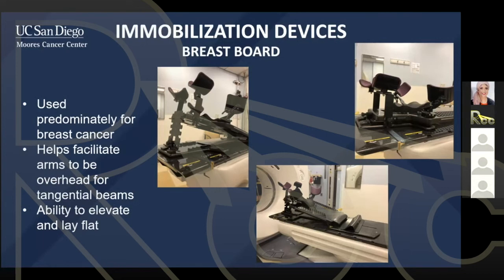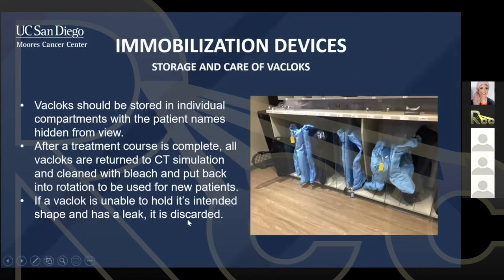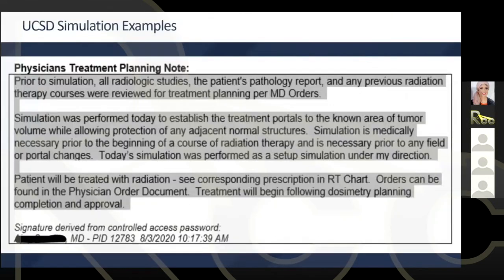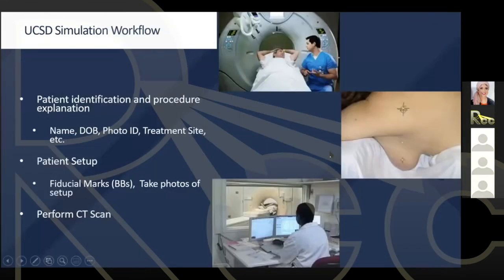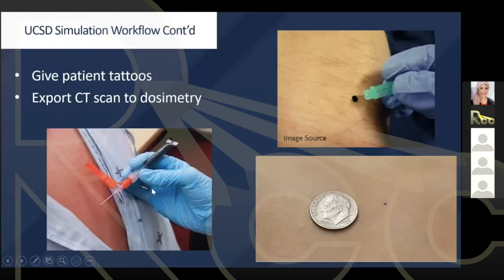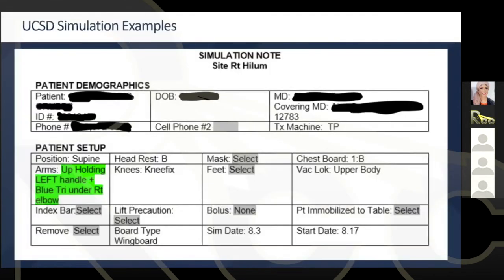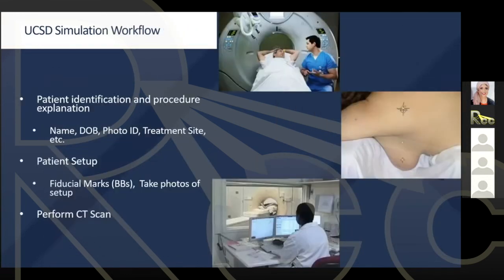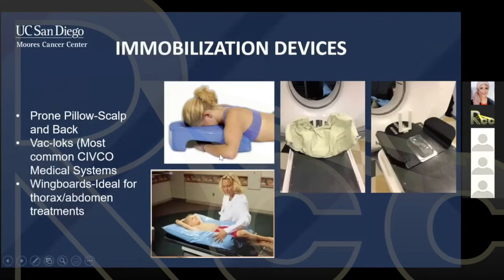Okay. So Zahra was asking about the previous slide, the patient with the tattoo. There is a breast patient with a tattoo. Can we go to the breast patient? Breast patient with tattoo. This one here? Keep going. Yes, this one? Okay. CI breast, prone position. Prone position. Yes. A different kind of breastboard.